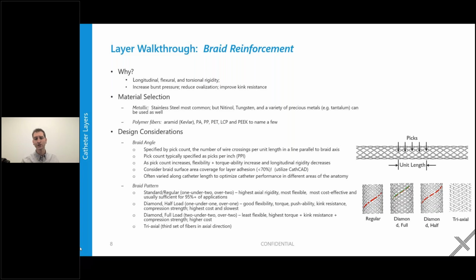Problem with that is it's not as good if you're doing transfer braiding. Because of that freedom of motion, your braid can kind of go awry a bit if you're doing transfer braiding, which, if you don't know what that is, is braiding onto a mandrel or a core, making that a little bit bigger than your device, and sliding it off of that core and onto your device so that you're not having to run braid stick-wise in your process. So it'd be a little bit more efficient way to do it and more cost-effective.